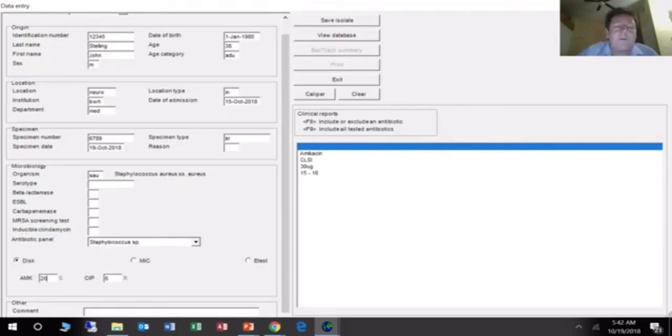The measurement is also very valuable for evaluating data quality, and also valuable for looking at epidemiology. If you have 2 patients in the same room, and one is high-level versus low-level resistance, the clinician doesn't care. If it's high level, low level, I'm not going to use that drug. But if you have two patients in the same room with Pseudomonas and one is high level gentamicin resistance, one is low level gentamicin resistance, that's probably just a coincidence. But if they both have high level resistance, I'd be worried about a contamination. Patient A infected patient B, or a healthcare worker infected both of them. So the measurements are very valuable for doing this kind of tracking.